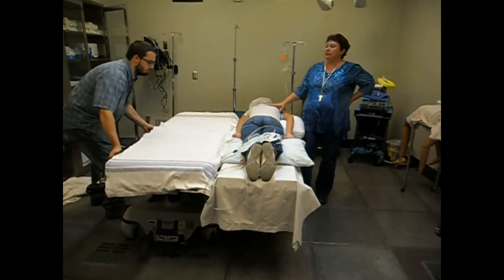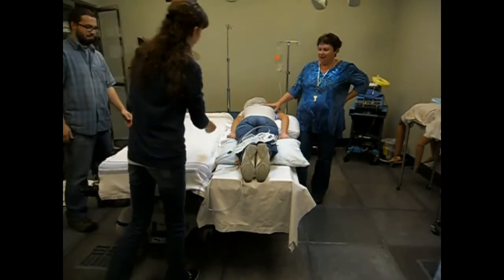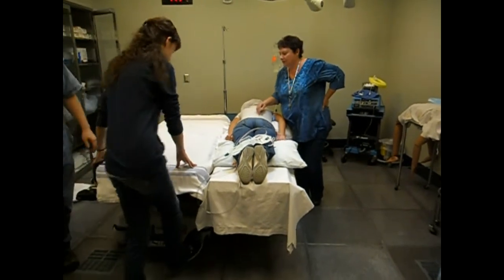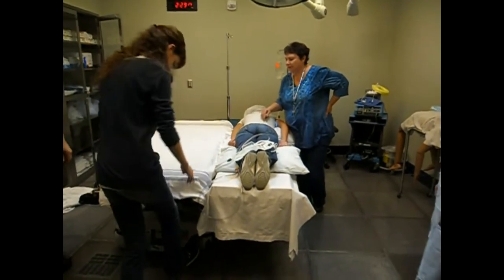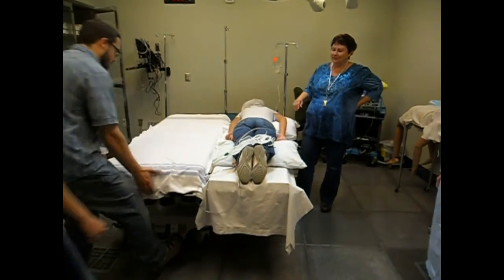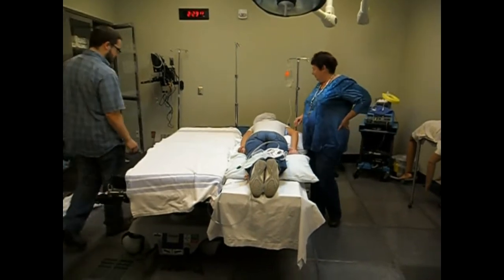And what do we have to do to our beds? Bump them. And lock them, yeah. Is that towel locked though? Yeah, is it locked? No. No? Here. Oh. All right, good for Jeremy.